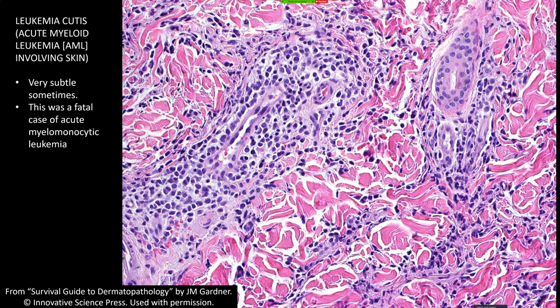And there's another topic we're not going to delve into today, but there's a variant of Sweet syndrome. Sweet syndrome, as you guys know, is neutrophils filling the dermis, but there's a variant called histiocytoid Sweet syndrome. My understanding of that disease is that it's like Sweet's, but instead of totally well-developed neutrophils, the neutrophils are a little bit more left-shifted. They look a little bit more like bands. And because of that, they can resemble myeloid cells. Myeloid cells are the precursor cell that eventually becomes neutrophils and a lot of the other white blood cells, right? So an immature neutrophil is a myeloid cell, basically, right?